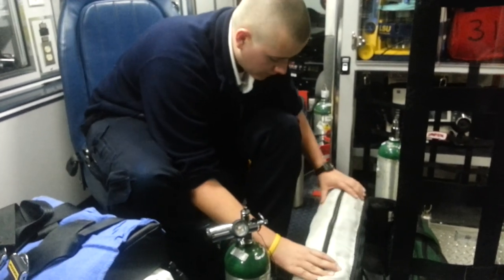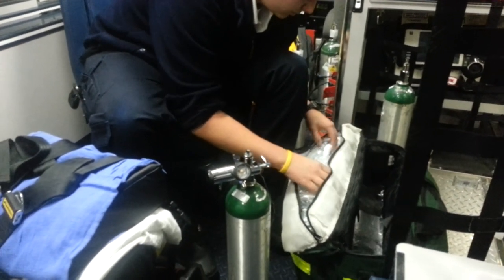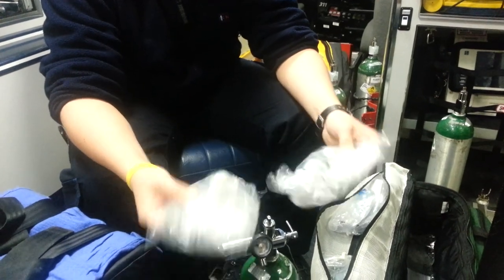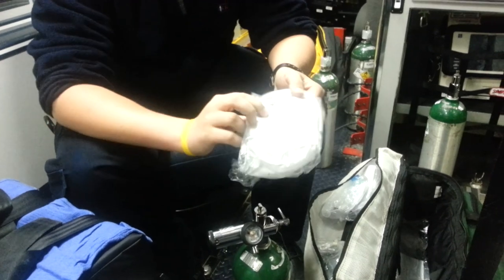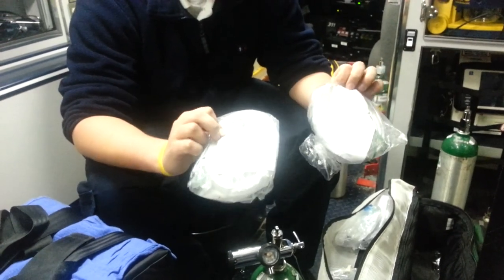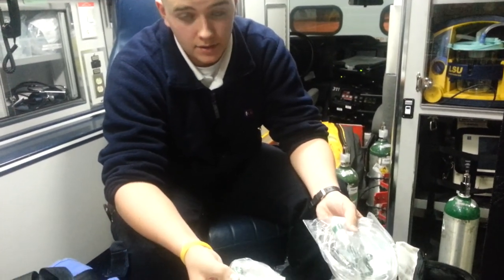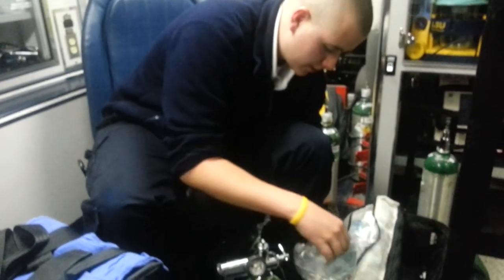In here should be all your non-rebreathers, nasal cannulas, nebulizers, and O2 tubing. Here we have two adult non-rebreathers — you can tell it's a non-rebreather because you see the mask and it says adult. And then we have pediatric non-rebreather masks — you can tell by the physical mask being smaller, and also the paper is blue. There are two of each right here.